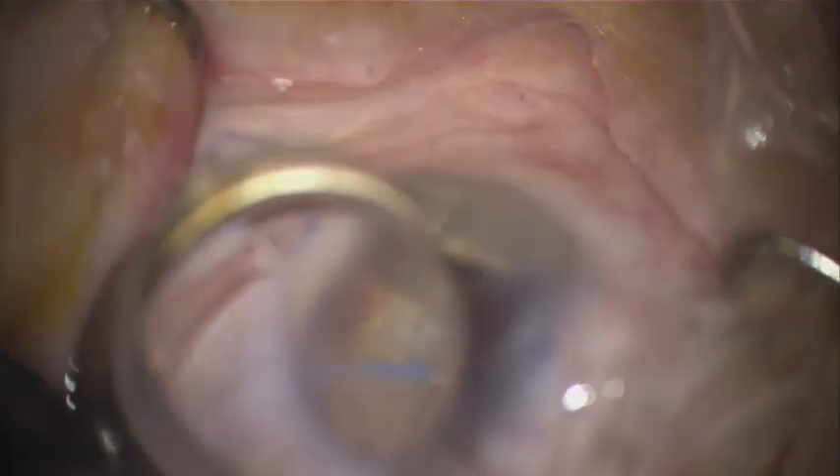Then we can turn the catheter around and then go in the opposite direction, superiorly, deploying the microcatheter into the Schlem's Canal and retracting. And that's the Omni.